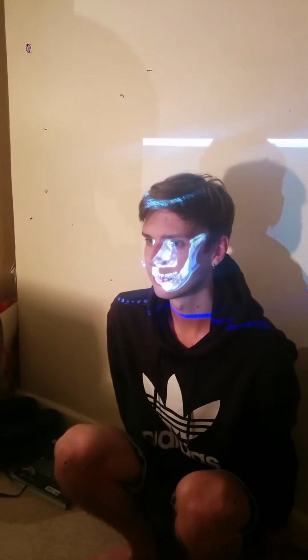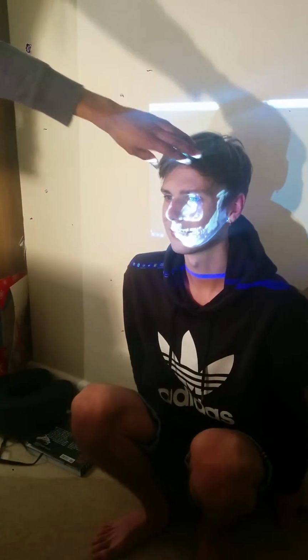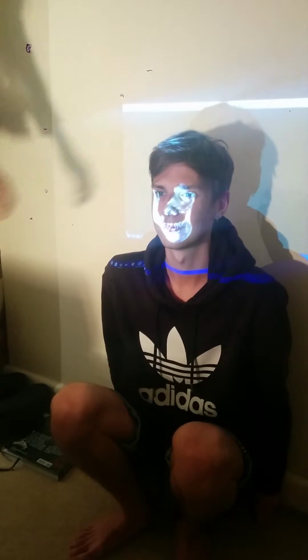Obviously this needs aligning, which will now be done. So, need to move back and slightly to the right. Sorry. Don't turn his head, translate his head.